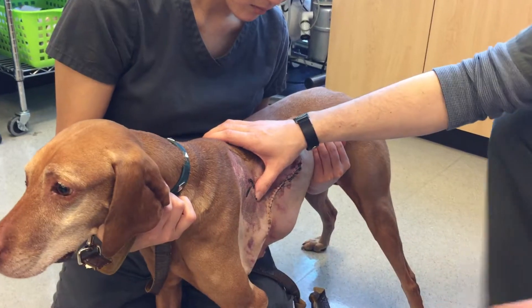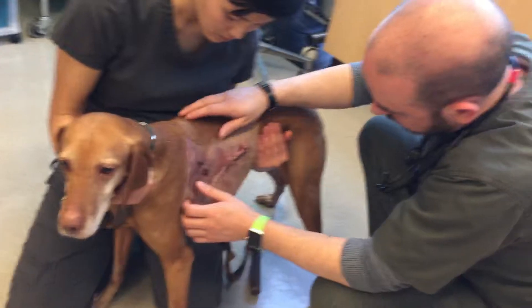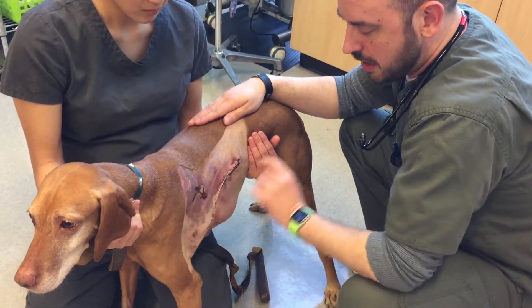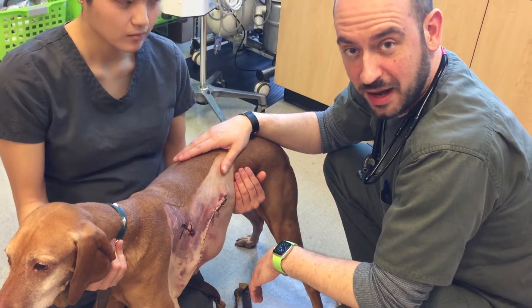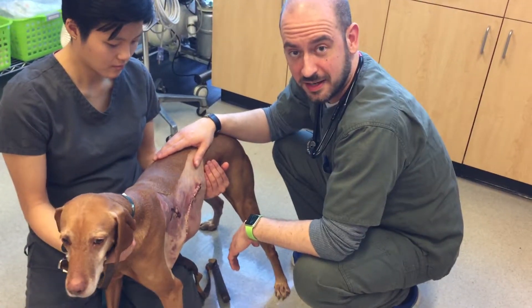Sometimes when you do the injection right before you remove the catheter, you will get a little bit of leakage, but this is actually looking great. I'm going to go ahead and clean her up, write up my record, and send her back to the owner. And that's how you remove an infusion catheter for local anesthetics after surgery.